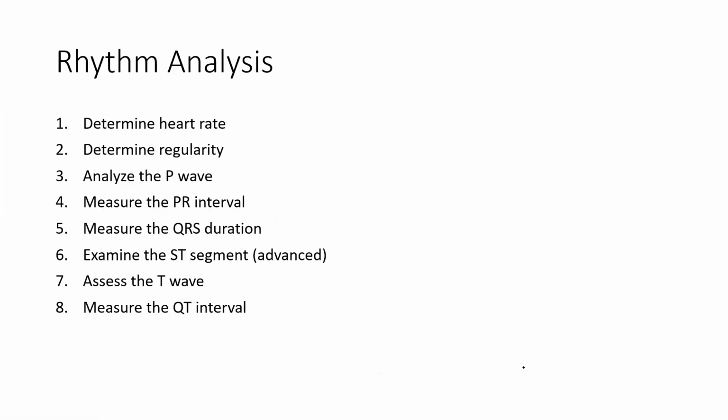All right, so let's get down to the nitty gritty now that we've gone over the foundational stuff, and that's how we analyze this rhythm. We have 8 primary steps that we want to do, okay?